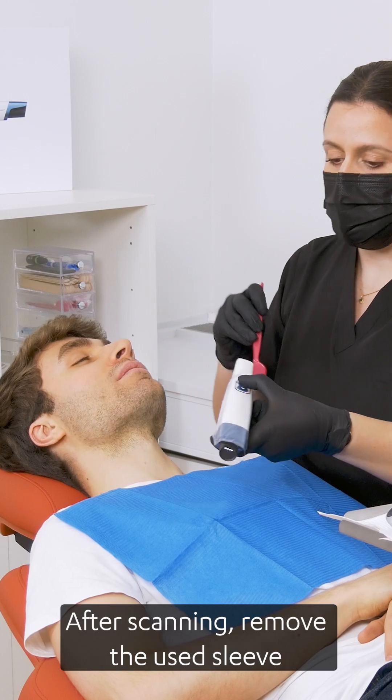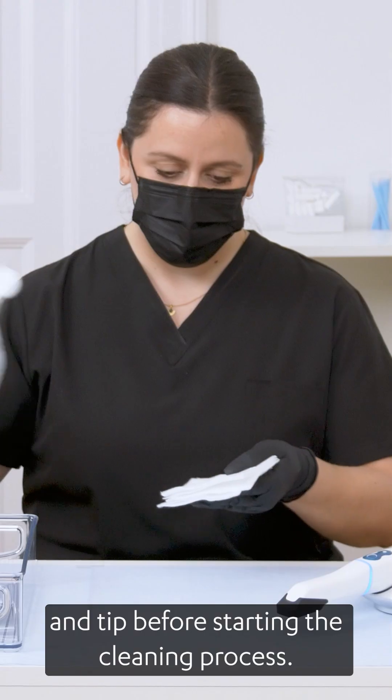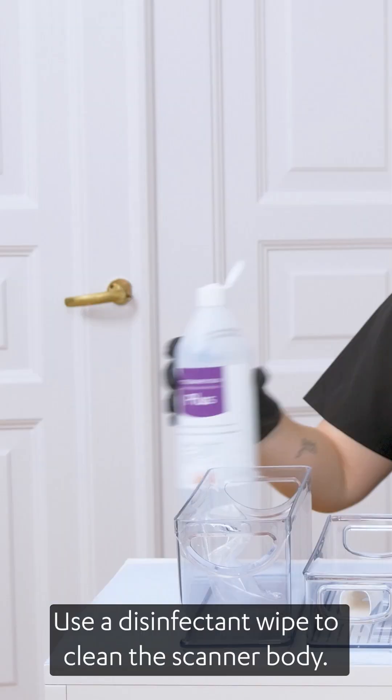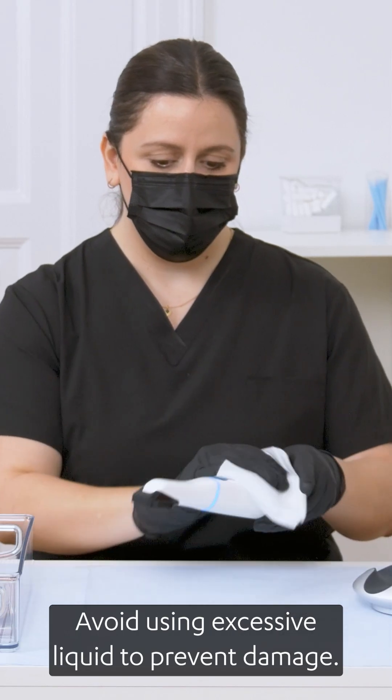After scanning, remove the used sleeve and tip before starting the cleaning process. Use a disinfectant wipe to clean the scanner body. Avoid using excessive liquid to prevent damage.